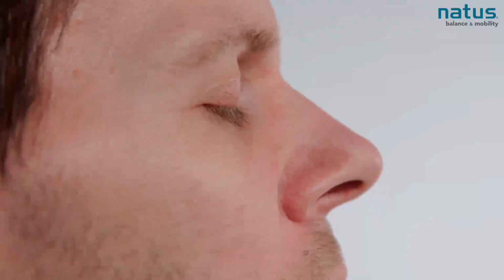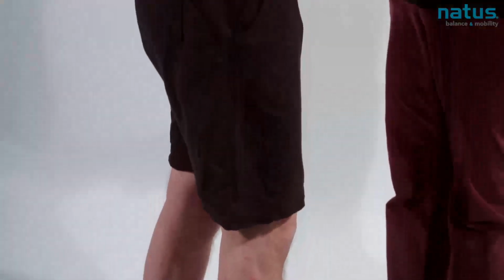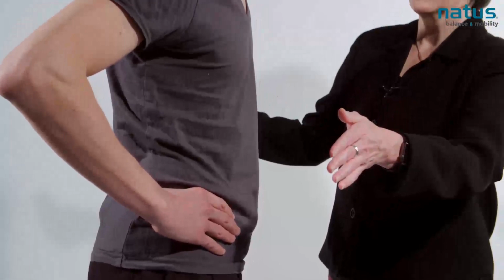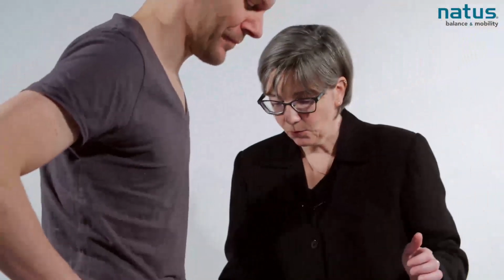Close your eyes. If you feel unsteady, open your eyes. It's okay. Get centered again. One more practice, eyes closed. Very good, open your eyes. Okay, so what we see in athletes very commonly is they make adjustments and they fight to keep their balance. That's expected.